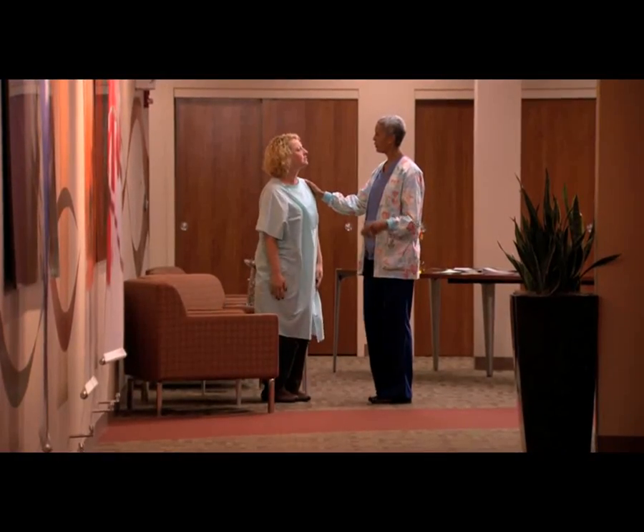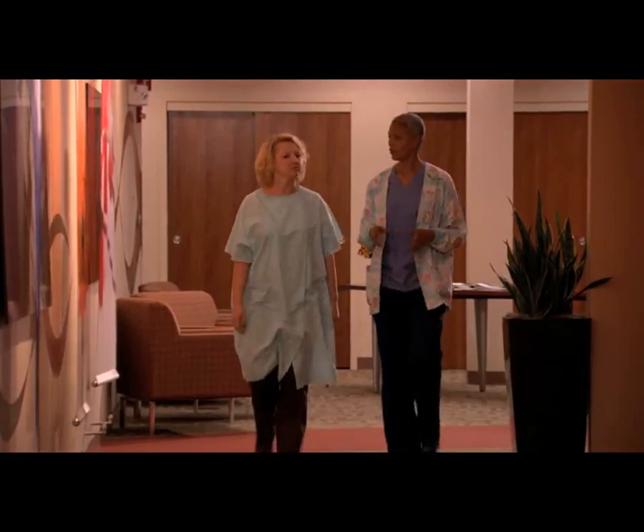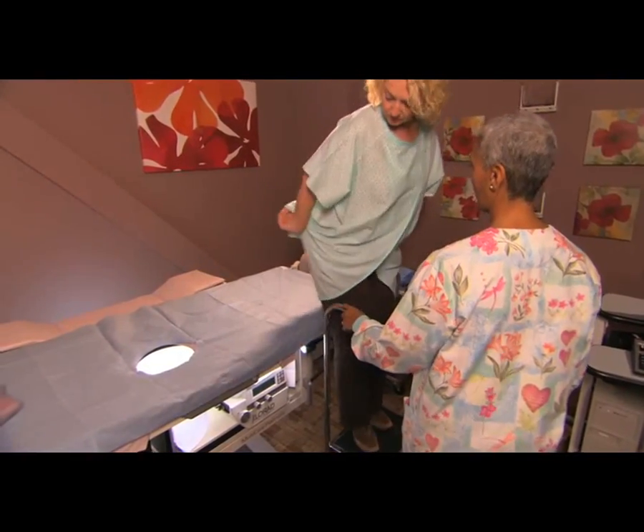Of course, it's okay to be nervous about any medical procedure. But it's really not quite as scary as it sounds, and it helps to know ahead of time what's going to happen.